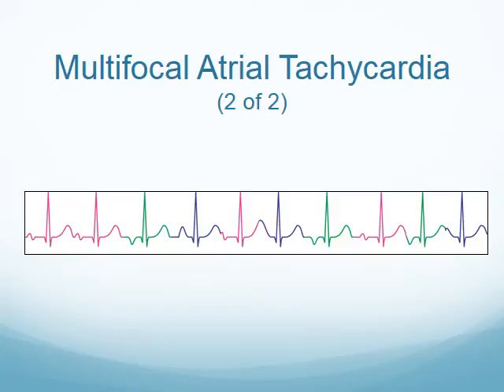Our first one here is the pink. That's kind of a biphasic P wave. The green is our undulated, negatively deflected P wave, and then our third one, our purple, is kind of that humped up, peaked P wave there. Notice that in this 5th complex we do have the P wave buried in the previous T wave, kind of giving it the appearance of a humped T wave there.